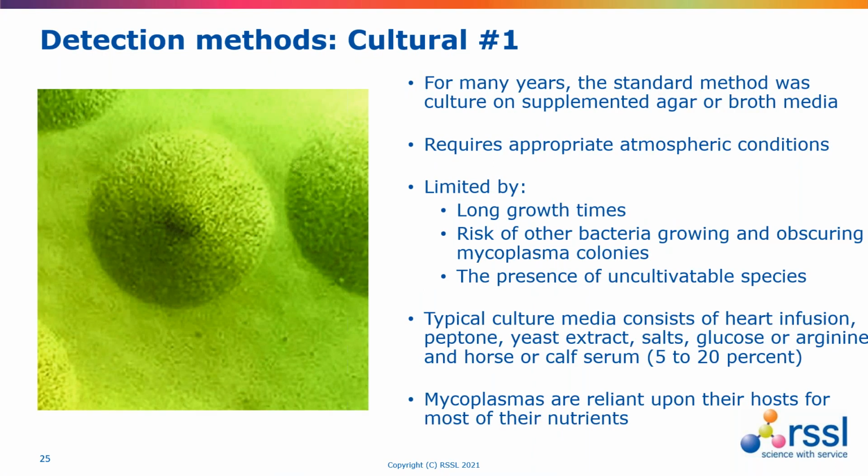So in terms of test methods, for many, many years, the standard method, and the method still described in Pharmacopoeia, is the culture-based method. So the culture-based method is the use of broth media and supplemented agar, and incubating a sample from the cell culture under the appropriate atmospheric conditions.